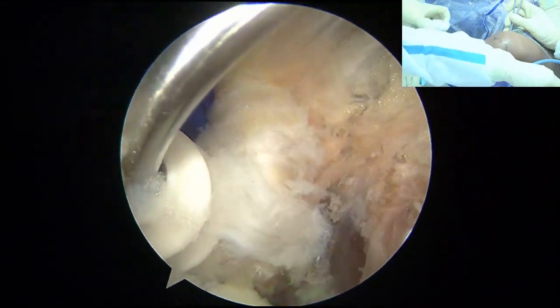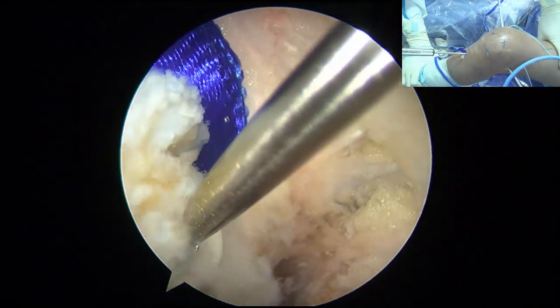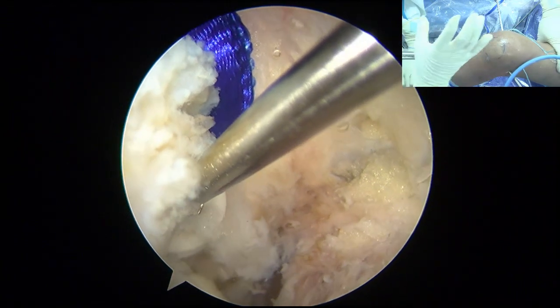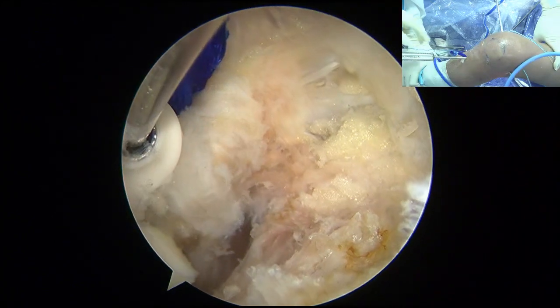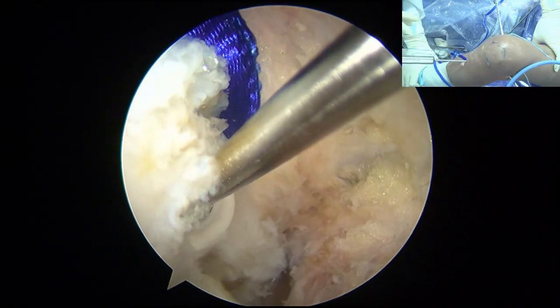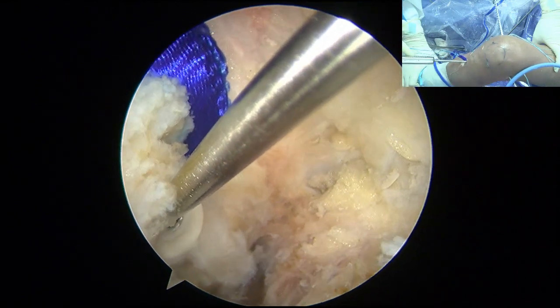This is good because you will have very stable fixation, because you have no movement in the tunnel. And also you can use a short graft. With a short graft, you can put the longer screw inside. If you put it here, you need a really long graft. Whenever you have a long graft, that means you have a slim, very thin graft. So that's my preference. I prefer to do it this way. Okay?